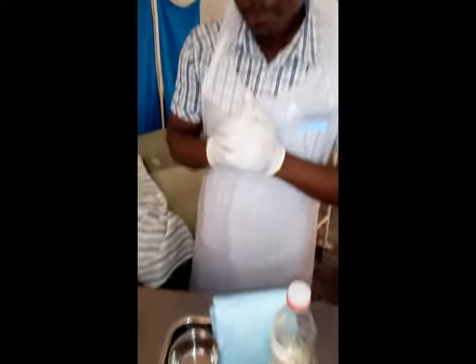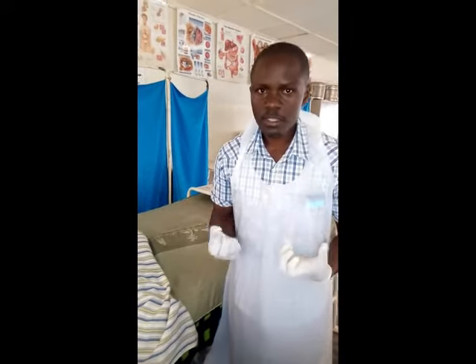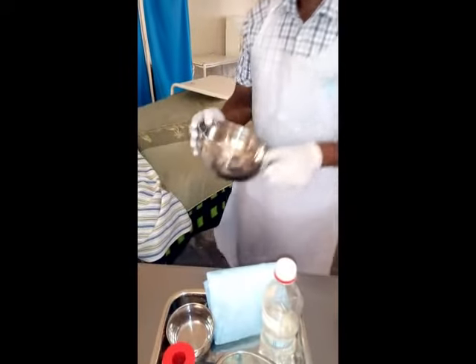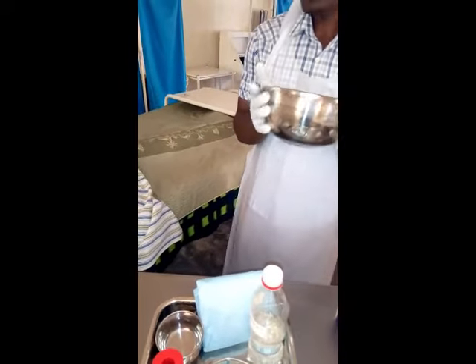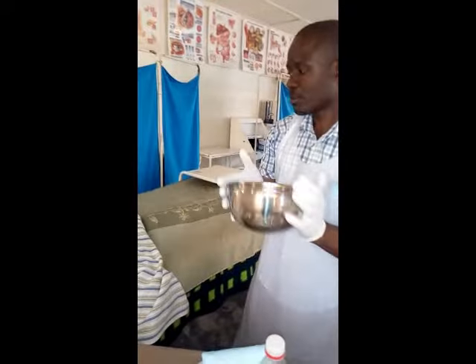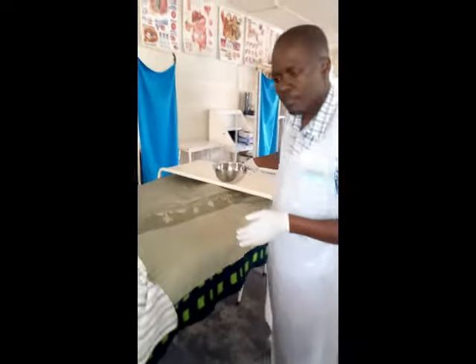Okay, so having done that, having marked, now we need to insert the tube. Before we insert the tube, it's time to get an emesis bowl, because this patient might want to vomit and we don't want to mess up the environment. We want them to vomit in this emesis bowl. You can put it here or somewhere close to the patient.